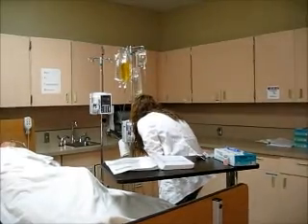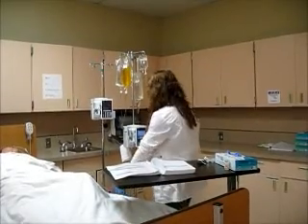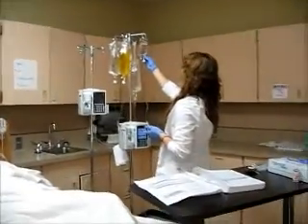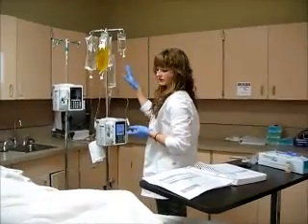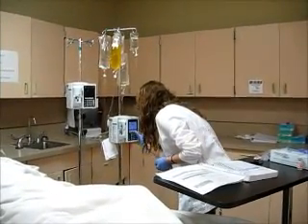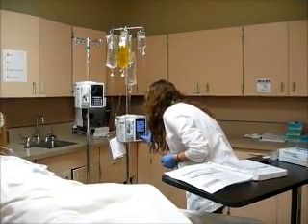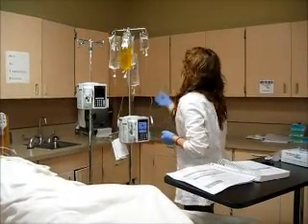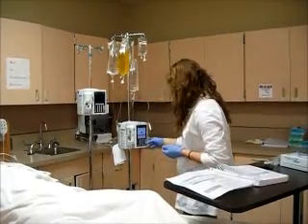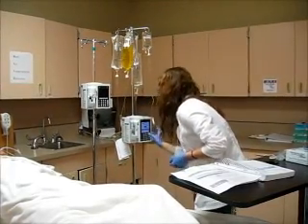Alright, and then I know my line A is already set, it's running, and so I'm going to go to line B, and I'm going to set it. I know I have 100 units in 100 milliliters, and I need to have 8 units over 1 hour, so I know I'm going to set it at 8 milliliters per hour. And I'm going to choose concurrent, 8 milliliters per hour, and I have 100 milliliters, so I'm going to put about 75 milliliters to be infused. And I'm going to press start.